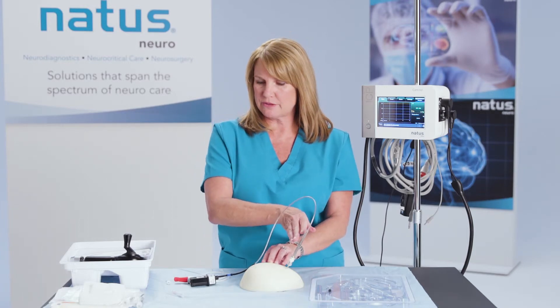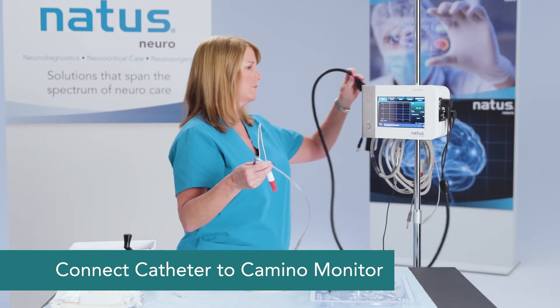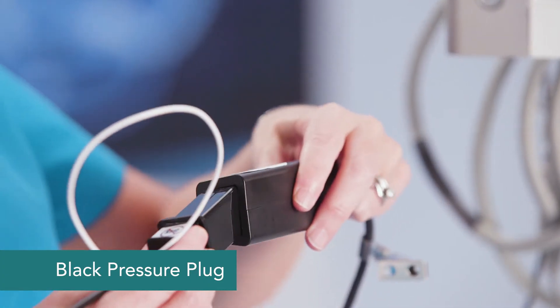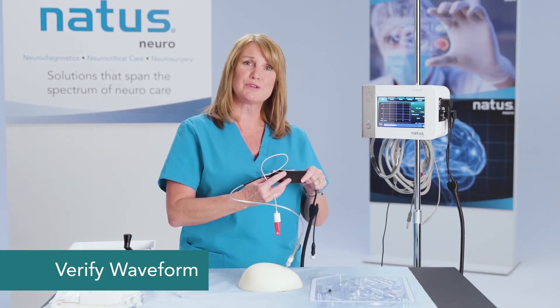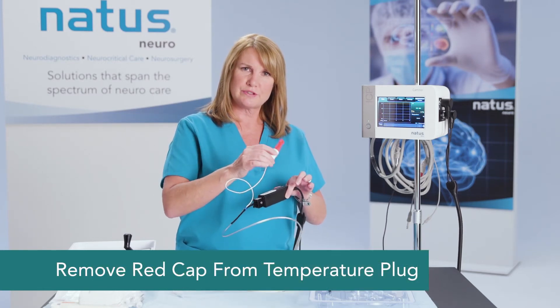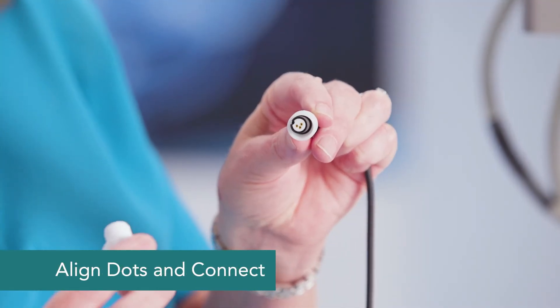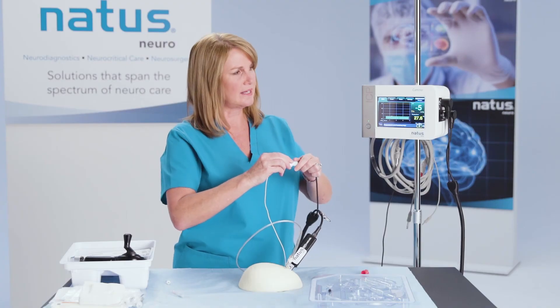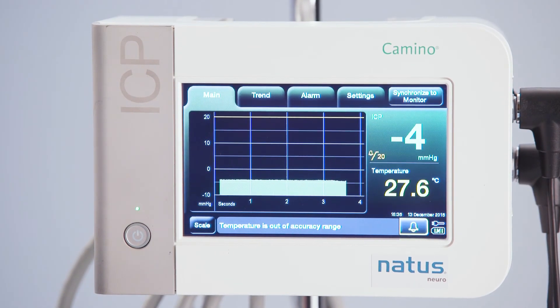After placing the catheter, you can go ahead and connect it up to the Camino monitor. The black pressure portion attaches here and just snaps right in. It will first say the catheter is initializing, and then we're going to look for a waveform. This particular catheter also allows for temperature — take the red cap off, align the three dots, and you'll have temperature showing as well. And that concludes placing the 110-4BT catheter.